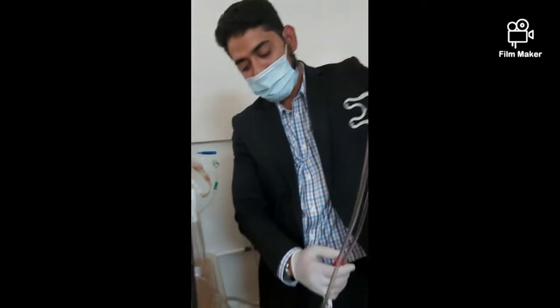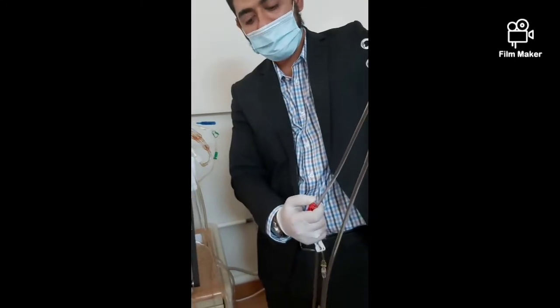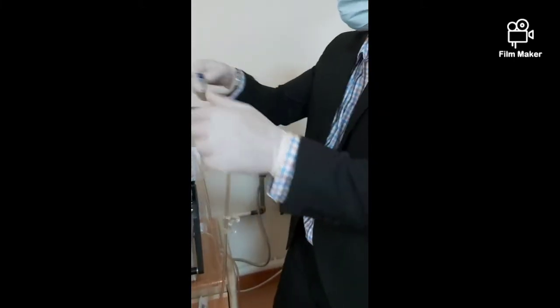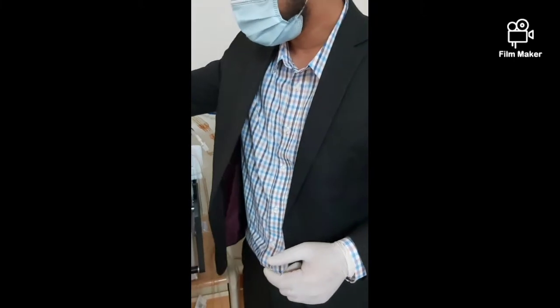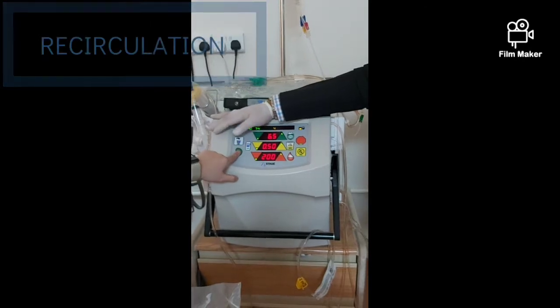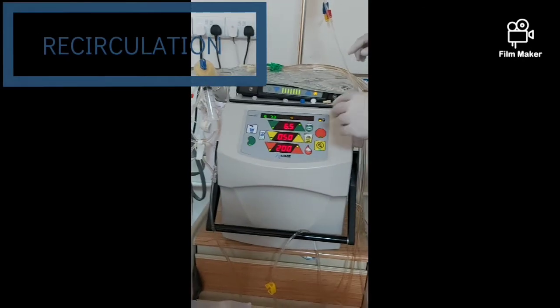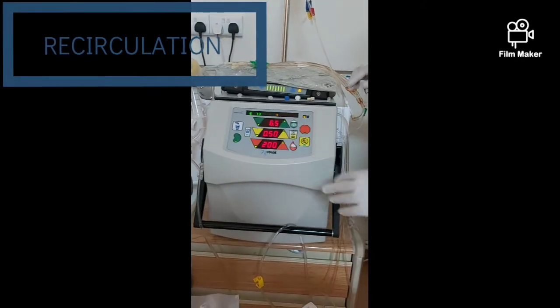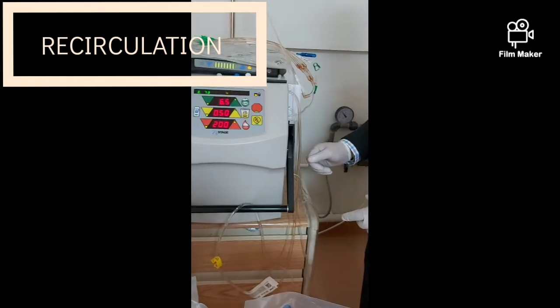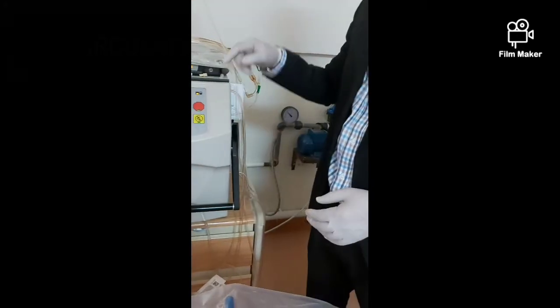So what are we doing now? Open the clamps — open, open. Open the clamps and leave it, then start. Let the blood come in — this is the process. Open the white clamp, then close the red clamp. This takes the saline and returns the blood to the patient.